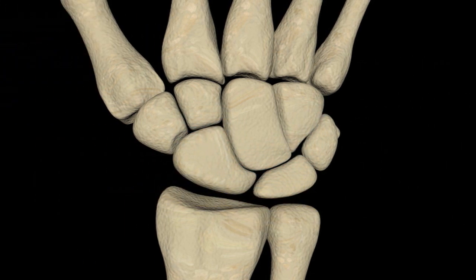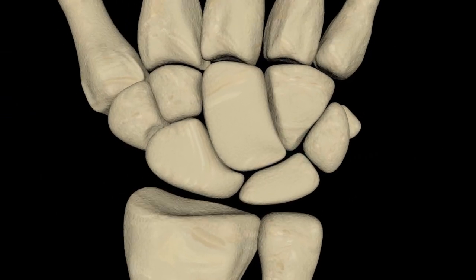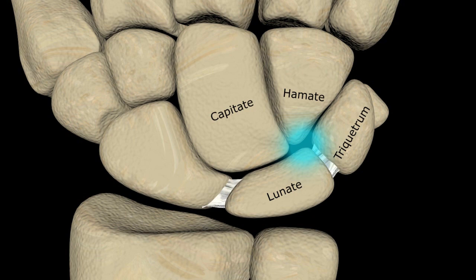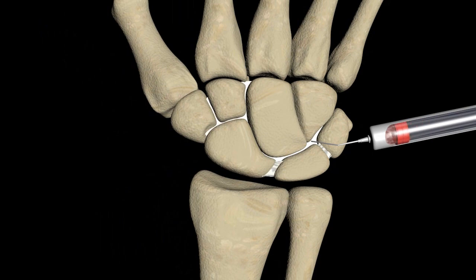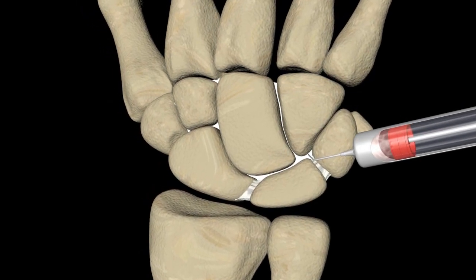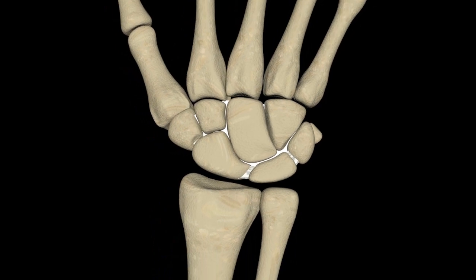For the midcarpal injection, I will slowly rotate the wrist during fluoroscopy to lay out the small intracarpal joint space formed by the four carpal bones: the lunate, capitate, hamate, and triquetrum. Following a small amount of local anesthetic, a 25-gauge butterfly needle is fluoroscopically guided into the joint space. Under fluoroscopy, the needle is injected while slowly pulling back until contrast freely flows through the joint space. If all structures are intact, the contrast will be contained in the midcarpal or distal wrist joint space with no contrast identified in the radiocarpal joint.